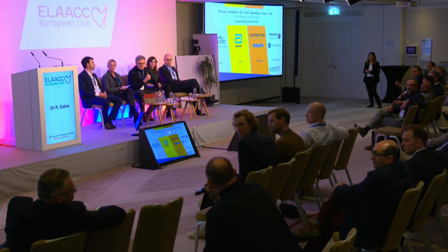Sven? It's just a comment. I think we have to understand why these controls were done in former times. The trials started with implantation of a new device, and we gave warfarin plus aspirin in the beginning, and then we wanted to see what happens before we stop the medication. I think this is important to know, and it can also guide us today.